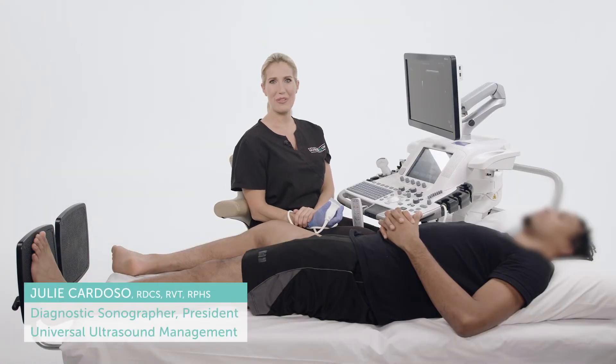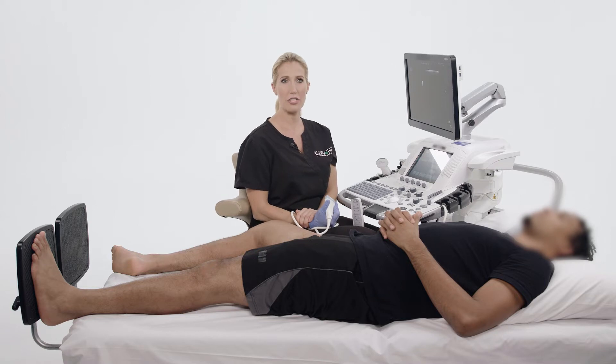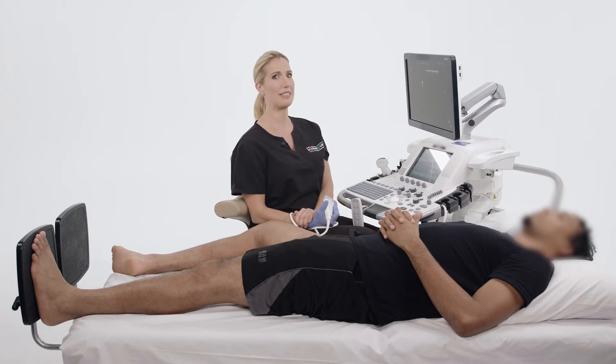Now that we have oriented ourselves, there is one more thing we must consider before manipulating the transducer. Remember that properly setting the ultrasound environment will not guarantee proper ergonomics. The most important thing is for the sonographer to follow proper ergonomic techniques.